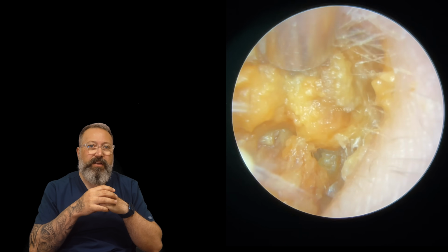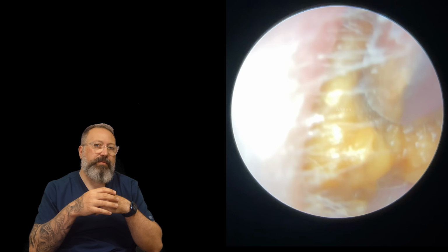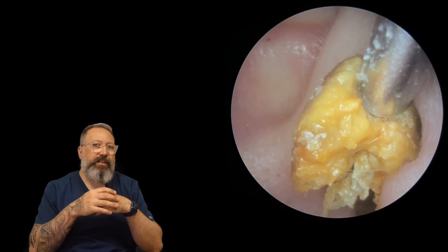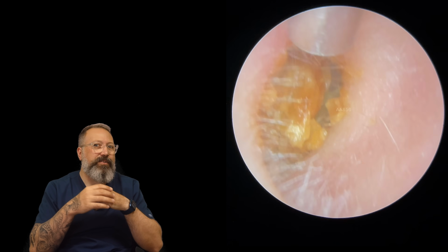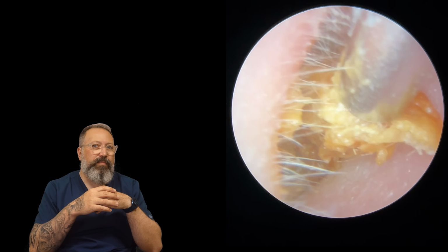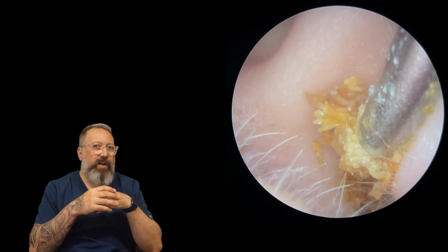We've got a very full ear canal. Lovely soft wax on this side though. But watch this as we start to pull some of this out. What you'll start to notice, this first section here, this is wax, but see that little tail of keratin? That gives you a bit of a hint as to what's going to be coming next. So it's a very, very full ear canal. But when we start pulling this now, you can see it starts to unravel a little bit.